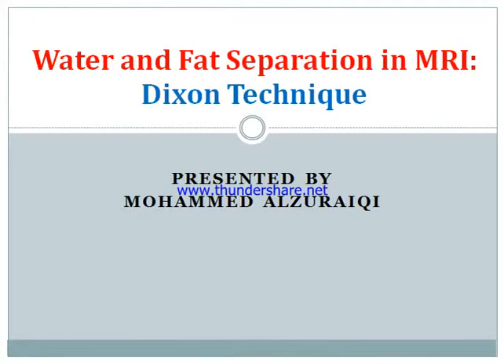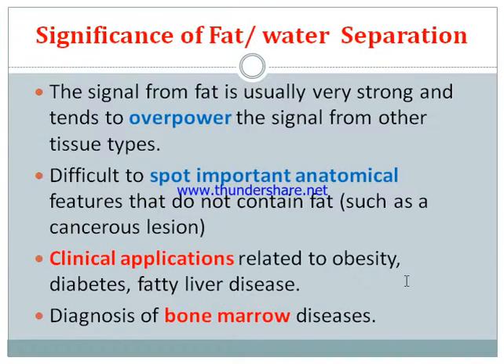Hi everyone. I would like to present about water and fat separation in magnetic resonance imaging using Dixon technique. Firstly, why this is important.